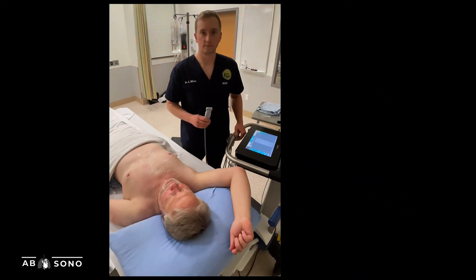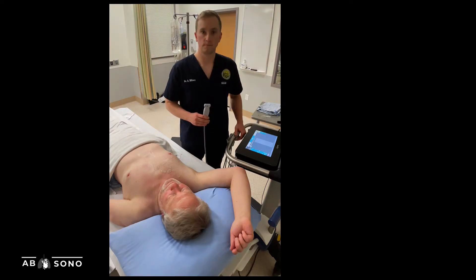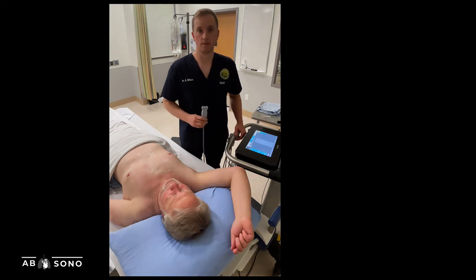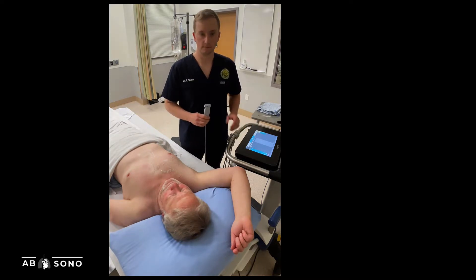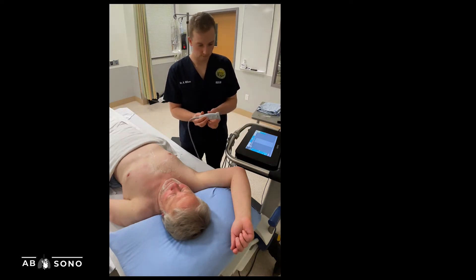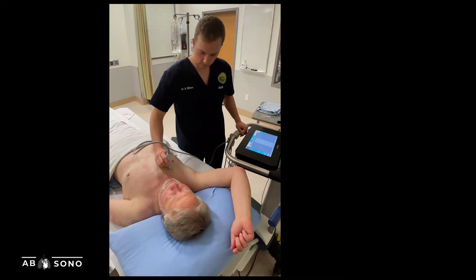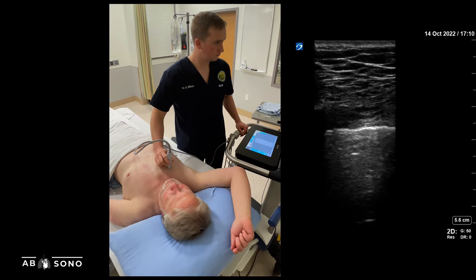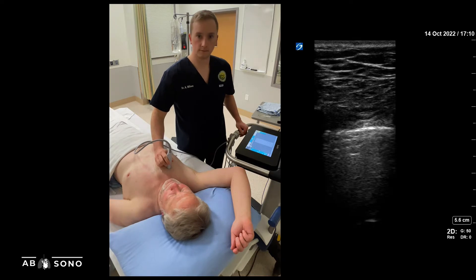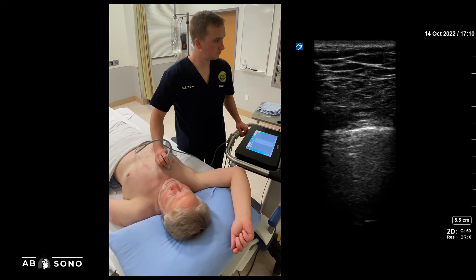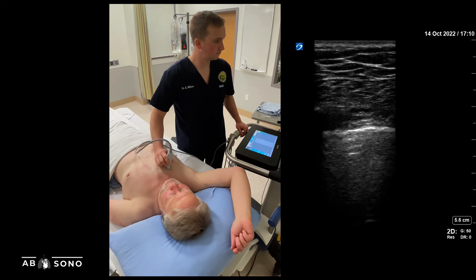For transthoracic lung ultrasound, let's start with a discussion of probe selection. As a high-frequency probe, the linear probe provides the greatest resolution of the pleural line. However, this comes with a penalty of greater attenuation and therefore poor resolution of deeper structures. If you are only interested in evaluating lung sliding, for example in ruling out pneumothorax, the linear probe is a reasonable choice.